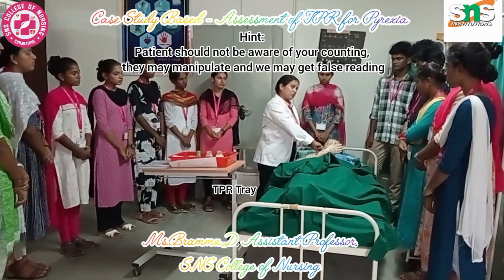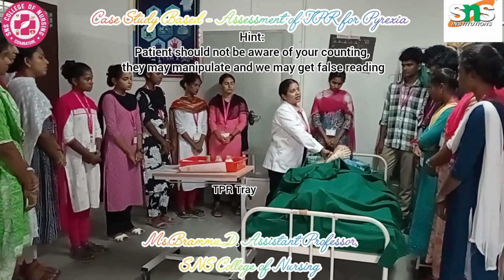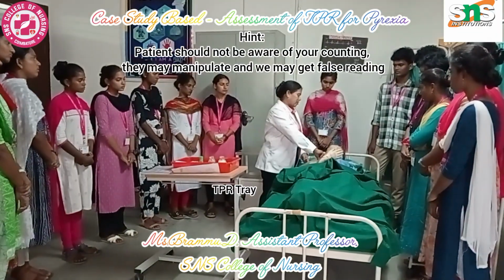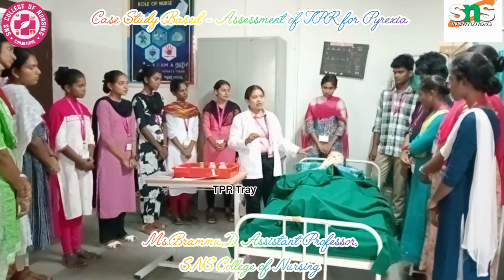Once the pulse is over, don't remove your hand. Even if you are counting only respiration, keep your hand on the patient's radial artery. After you count the chest wall movement, the procedure is over. Meanwhile, the oral temperature is also completed.